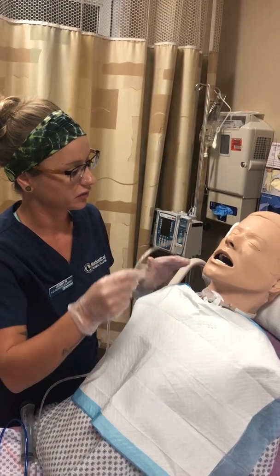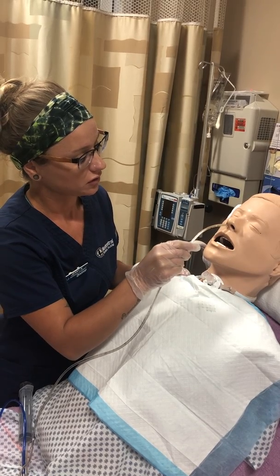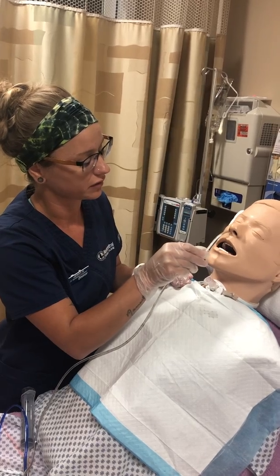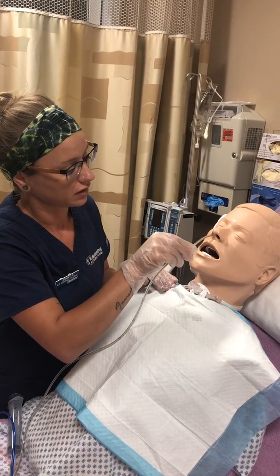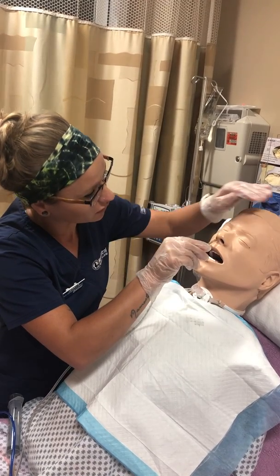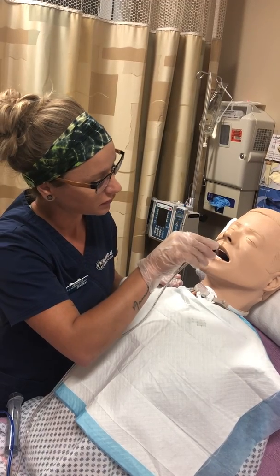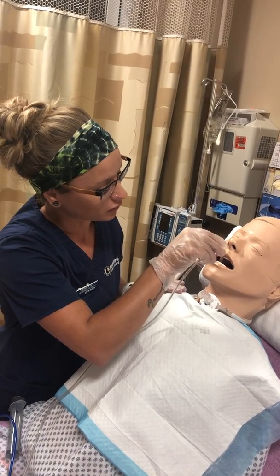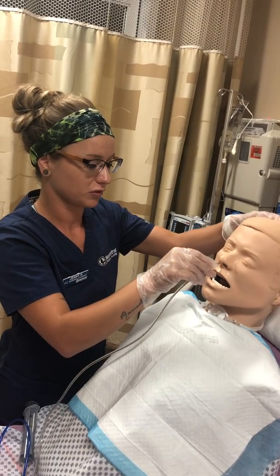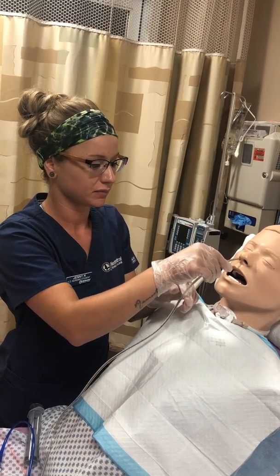All right, Jennifer, I'm going to start inserting the tube. And I'm following the natural curve, going in through the nostril, back through the nasal pharynx, following the nasal floor. We have her hyperextend her neck, and she's able to do that for me. And once I reach the oral pharynx, or maybe my patient starts to cough, that's when I will have them tilt their chin to their chest. So she's tilting it for me.